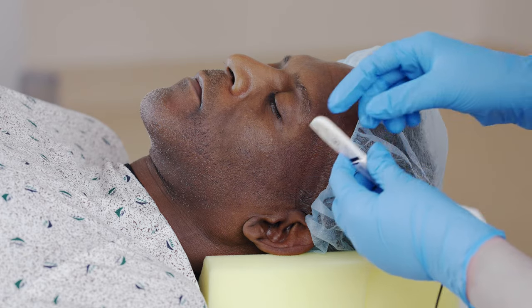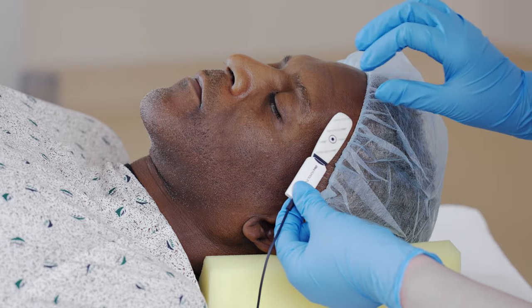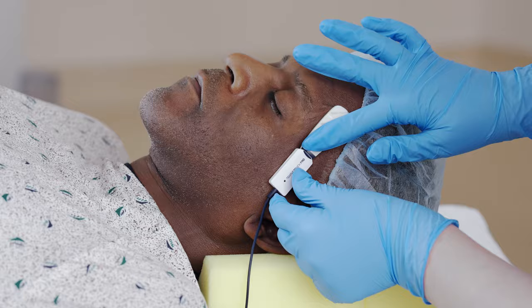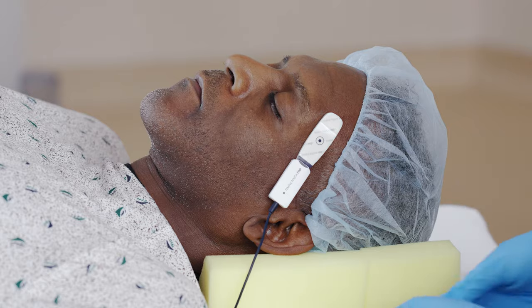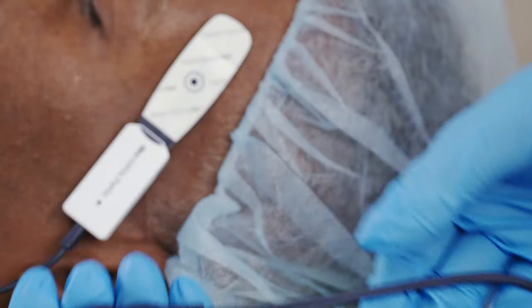Insert the sensor into the connecting cable, then remove the liner to expose the adhesive. Place the center of the sensor on the patient's temple, between the hairline and the eyebrow, so the cable is pointing away from the patient's eye. Gently press the surrounding edge of the sensor to ensure good adhesion to the skin. Link the two sections of the breakaway cable to connect the sensor to the MCU.